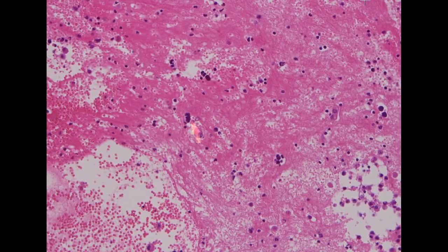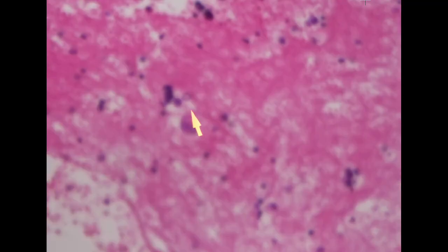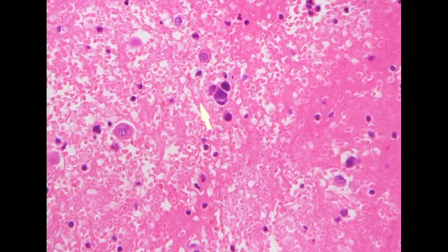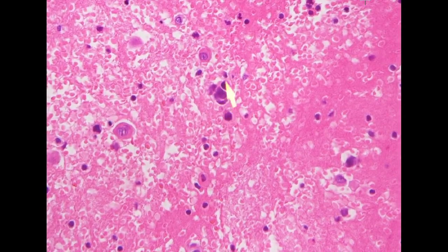Here you also see this Indian file molding pattern. This is small cell carcinoma. Okay, here you start to see the cell-in-cell pattern and the molding as well. So this is small cell carcinoma involving the pleural effusion.